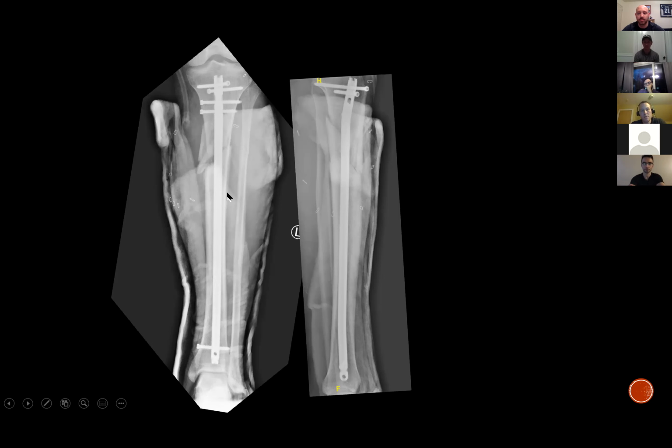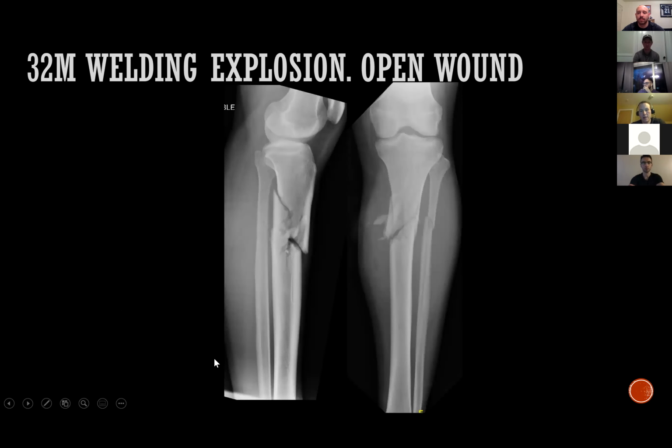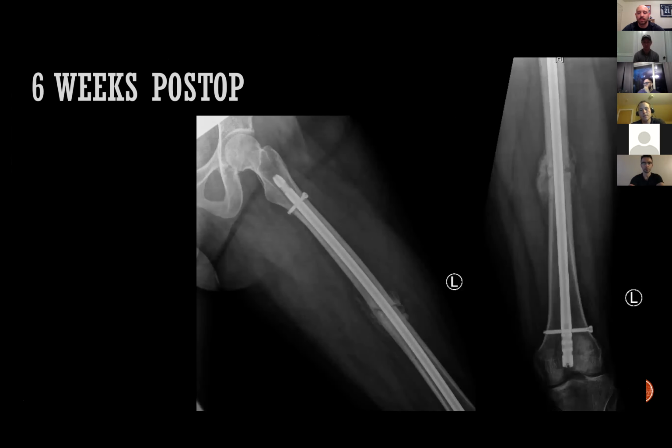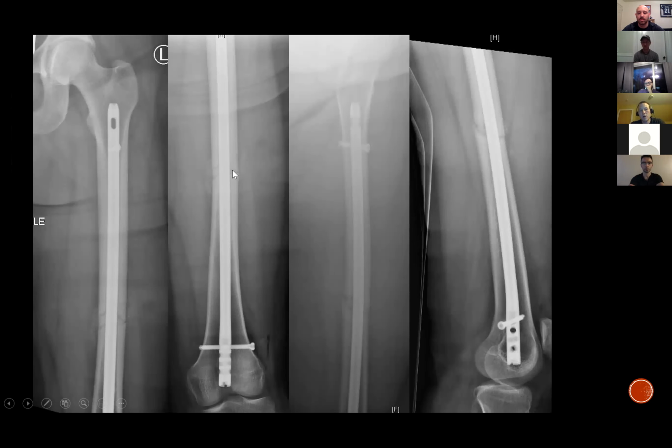And that would be because those screws are being asked to resist an axial load. Whereas in this femoral shaft back here, this fracture is all but perfect. Every edge of the bone is lined up on top of one another. This fracture is not going anywhere. You could do almost nothing to it and you could just leave the nail in. It's not going anywhere. These screws are not being asked to do very much work. The more comminution you have, the more shortening that could happen, the more forces that are going to be seen on those screws. That's when you start adding more screws.